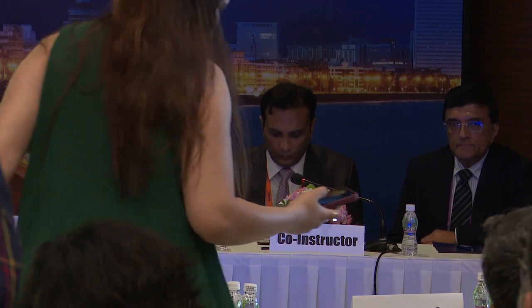Just to summarize Dr. Ajay's AURORA, the get-home message: if you have a submacular bleed which is extramacular, you don't have to fight very much for it. As much as you're comfortably able to remove it, you can make a retinotomy and remove it with the back flush. If there is a large submacular bleed, it can lead to a grave prognosis. First of all, you have to prevent it with liberal use of PFCL. And if it occurs, the best method is to create a retinectomy, lift the retina and remove the clot. That is the most atraumatic way, without damaging the underlying retina and the choroid. Once the clot is removed, you can just proceed as a normal giant retinal tear surgery.